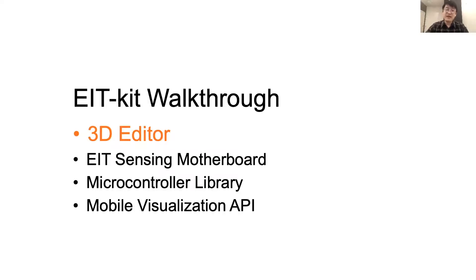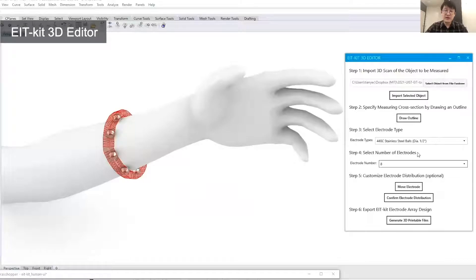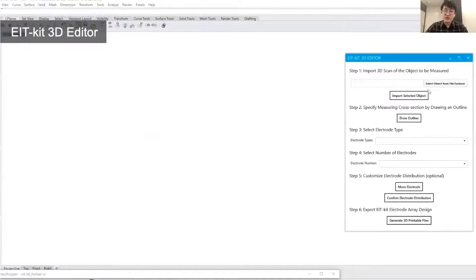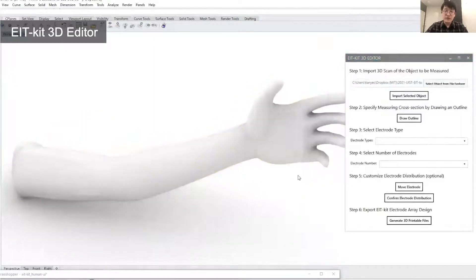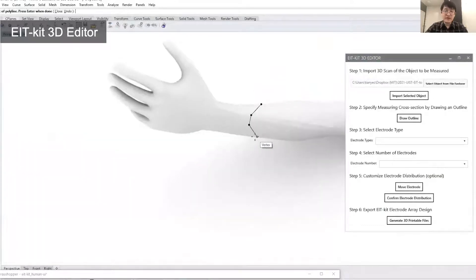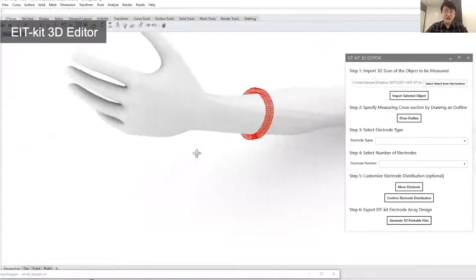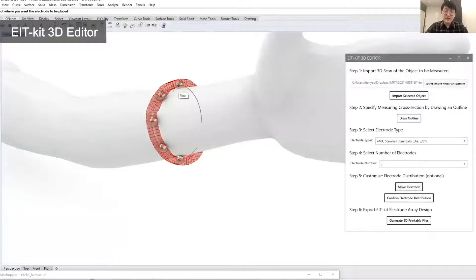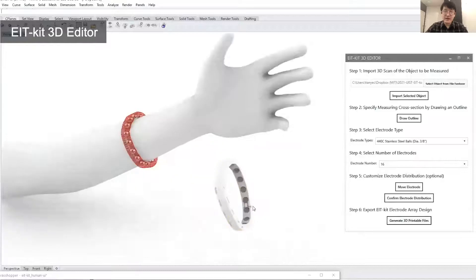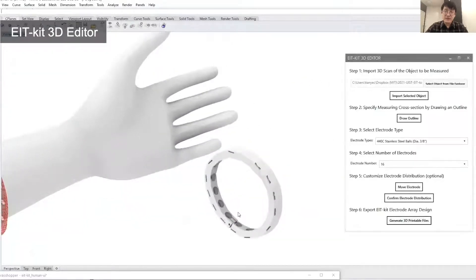EIT Kit's 3D editor is built as a plugin for Rhino Grasshopper. The user starts by importing a 3D model of the subject to be measured — in this case, a 3D scanned forearm model. The user then specifies the sensing area by marking the corresponding faces, and EIT Kit will automatically generate a form factor that fits tightly around it. Next, the user specifies sensing resolution by selecting electrode types and number of electrodes. Instead of sensing evenly, users can also customize electrode distribution to create higher sensing resolution in a specific area. Once satisfied with the design, users can export it as a 3D printable file, with electrode spaces saved at the corresponding locations.